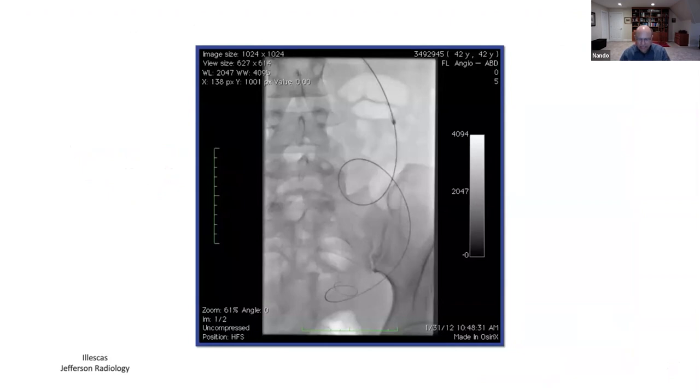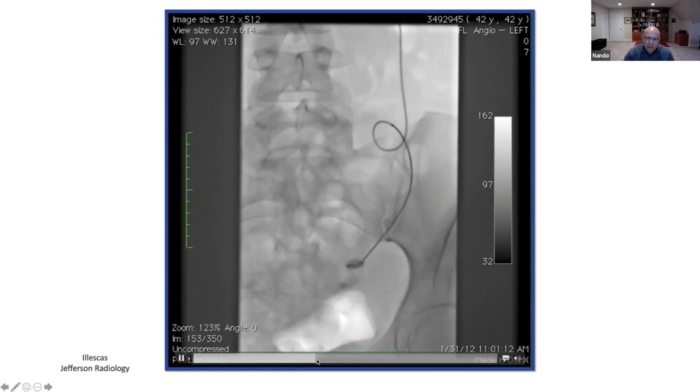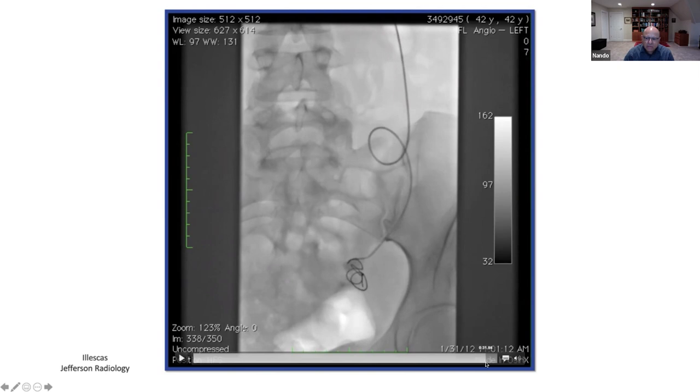This is again an image of the wire as demonstrated previously. A catheter has been passed distally into the gonadal vein, and a soft, long Nestor coil is being pushed by a guide wire to be deployed distally into the gonadal vein.